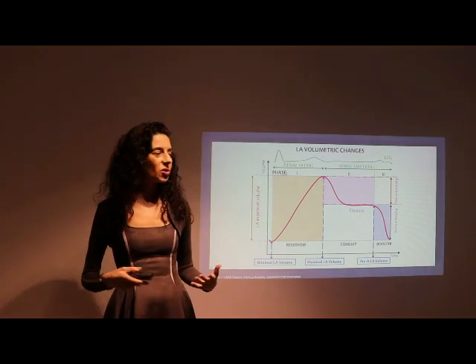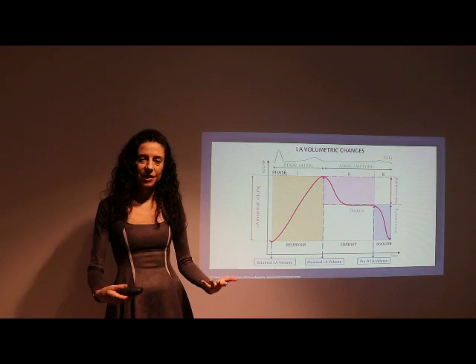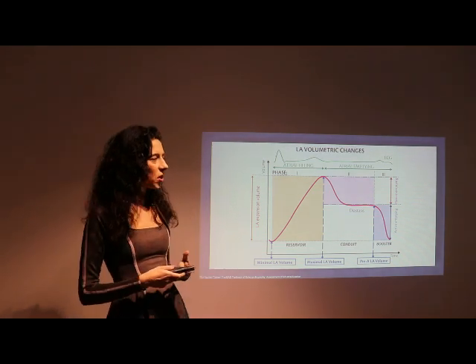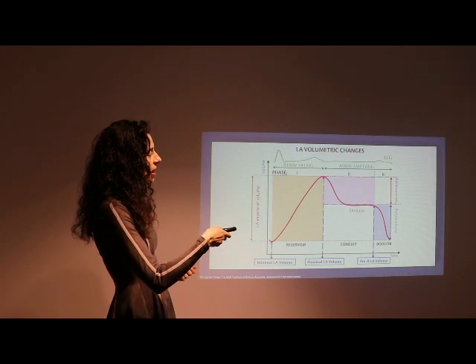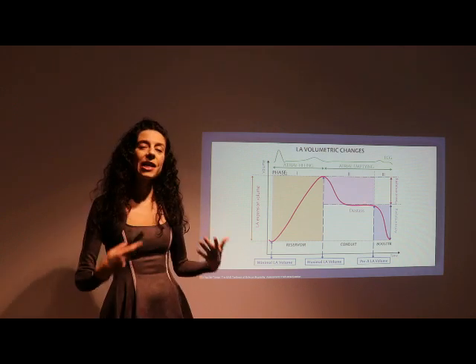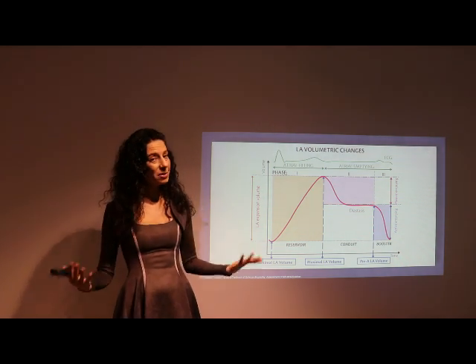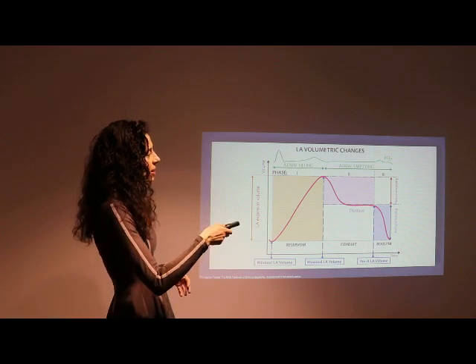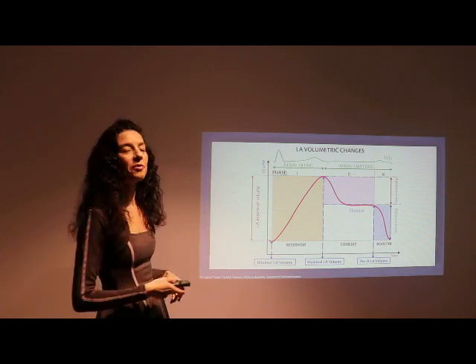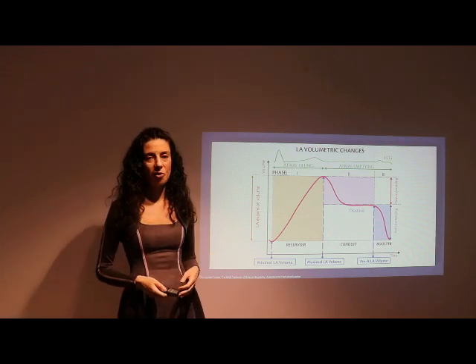Then during diastole, we have an emptying of the left atrium, which is at first passive emptying during the diastasis, and then active emptying during the pump function in sinus rhythm, of course, of the left atrium. So we have the passive emptying volume and the active emptying volume.